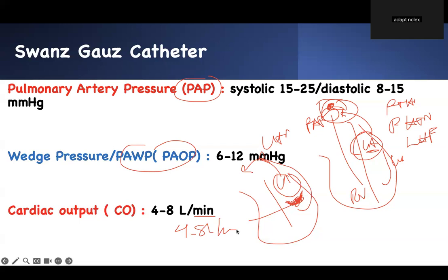The next one that we'll talk about will give you a better idea whether your heart is doing a good job or not, because the volume that comes out should be analyzed based on your body surface area. So if you're big and you put out 4 liters, it may not be enough because you may need more volume, right? That's why the range is 4 to 8. So it does not take into consideration the size of the individual. Of course, when the cardiac output is high, it's hyperdynamic, right? When it's low, that means you have heart failure. Hyperdynamic means you're moving very fast, you're using a lot of energy. If the cardiac output is low, it means you have heart failure, or you may have something related to MI, and your stroke volume is very low. So that is the difference. This is the information you can get from the cardiac output.